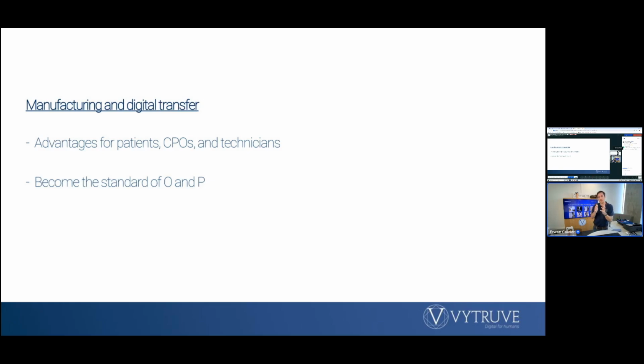When the check socket is okay, to scan the check socket, TT, TF, TR as you want, to print directly the definitive socket, or to laminate on an installation guide and positive to deliver to your patient a very nice socket, and your patient can keep the check socket during the definitive.